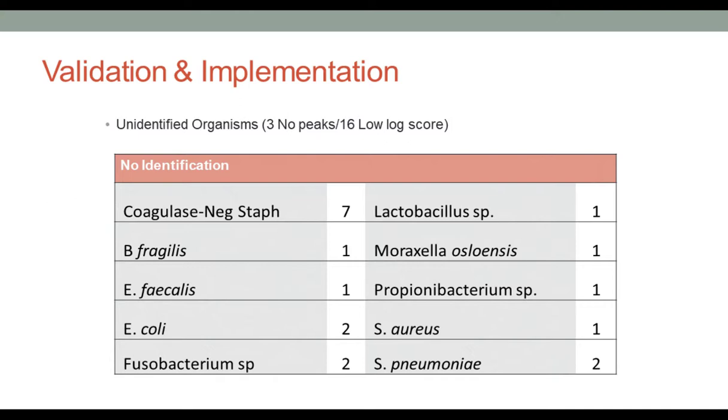Actually, we don't usually perform the extraction method. Since we have a culture that we're working with, we can get an identification usually the next day if we need to do that. The main goal here is to get a rapid identification. If you have to go through that extraction process, it takes a little bit longer, and our physicians didn't feel like that was necessary.